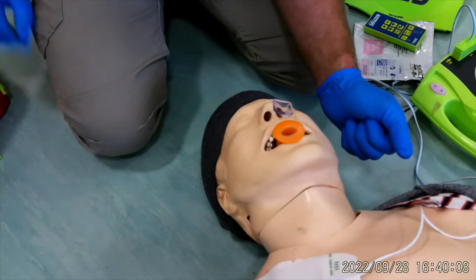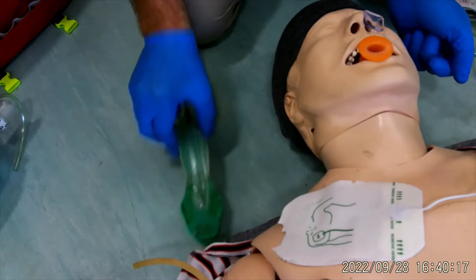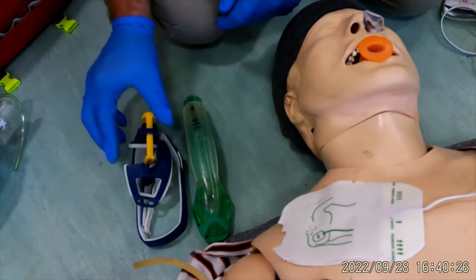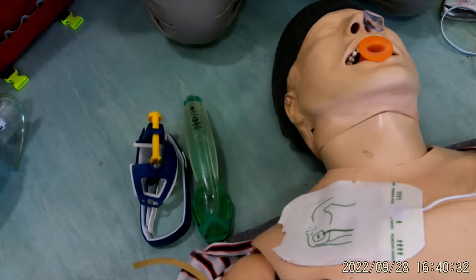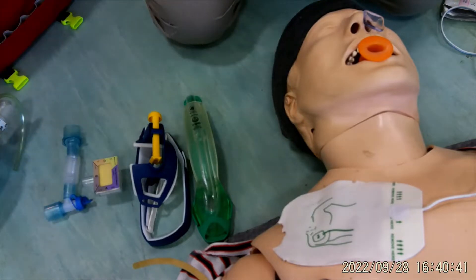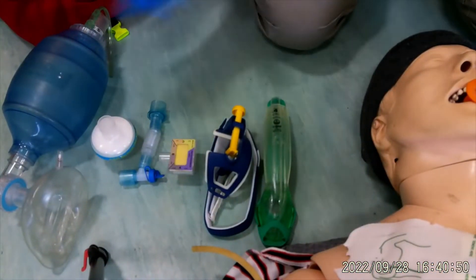Whilst my colleagues are doing chest compressions, I will prepare all of my equipment. I choose an i-gel according to the patient's weight, then line all my equipment up: the i-gel, lubrication if needed, a Thomas select clamp, a colorimetric device, a catheter mount, a filter, and finally my BVM. I like to line everything up in order so it's ready to go.